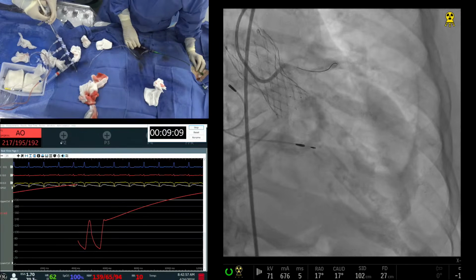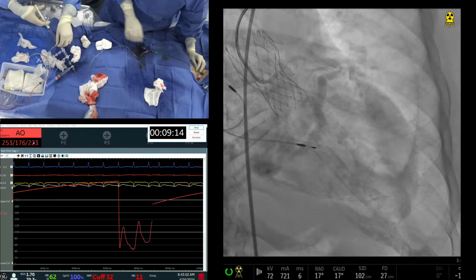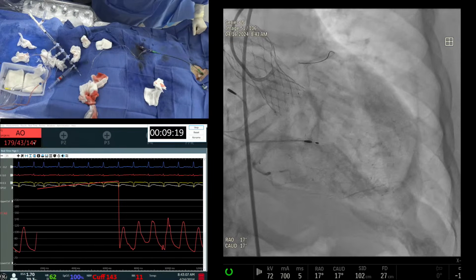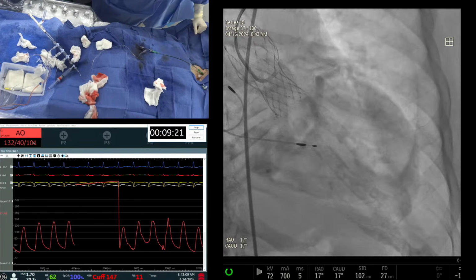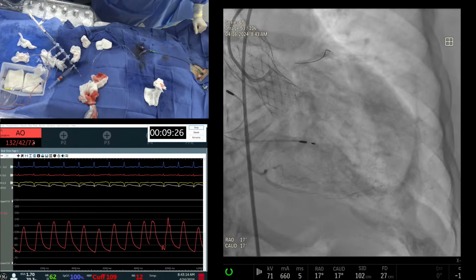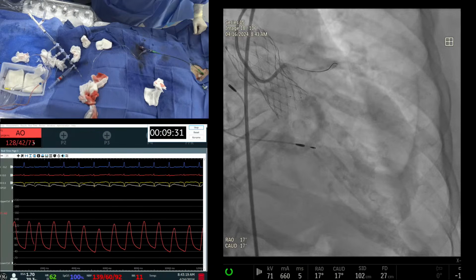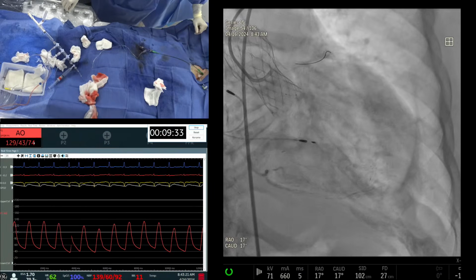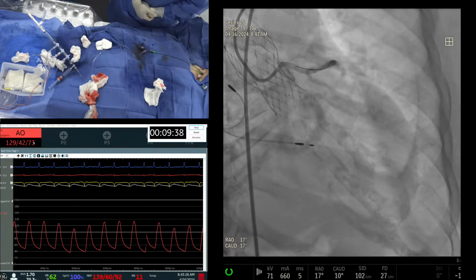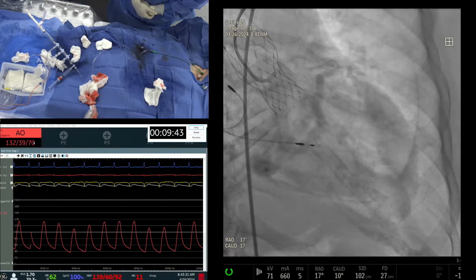May not go further. Exactly the question regarding the FFR asked by Dr. Rice. Yeah, that's absolutely correct. Although there are trials ongoing at present on FFR-guided intervention in post-TAVR patients, the guideline at present is very simple: if you have more than 70% obstructive disease of the epicardial vessel, you just go and stent it. That's the guideline, because you cannot do FFR or iFR, which is more troublesome, and they cannot have a stress test. So it's just by angiographic guidance.